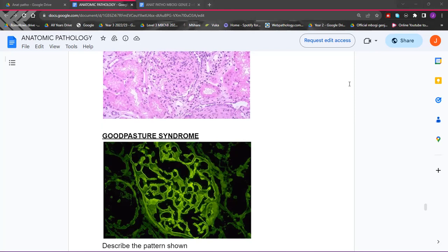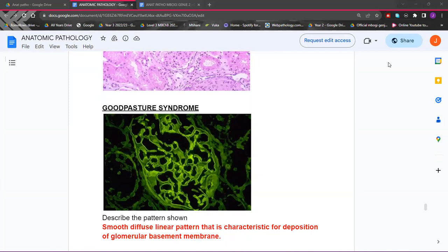This is a type of rapidly progressive glomerulonephritis caused by cellular injury to the underlying glomerular basement membrane, which leads to it becoming permeable to red blood cells and inflammatory mediators, and this will lead to deposition of these complexes. When you expand a normally thin membrane and allow many more substances to enter, you'll have inflammation, and this inflammation will lead to the breakage of the membrane, and therefore you'll have this appearance under immunofluorescence, Goodpasture disease. So maybe any clarification you want on Goodpasture? Maybe I can try to explain it better.